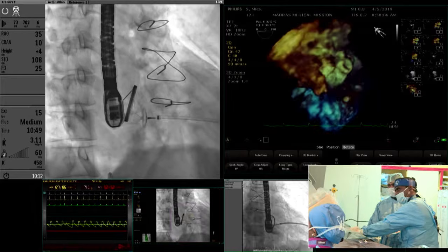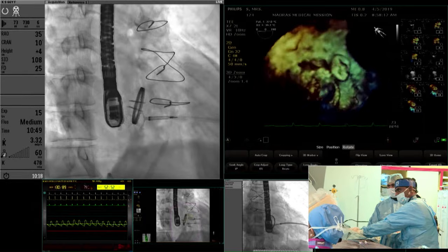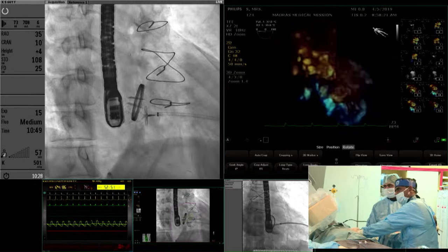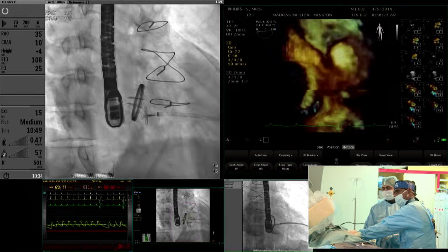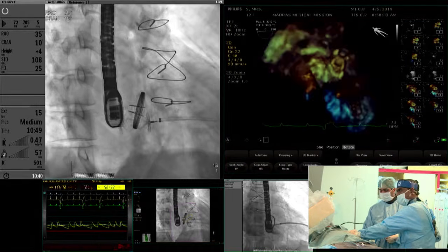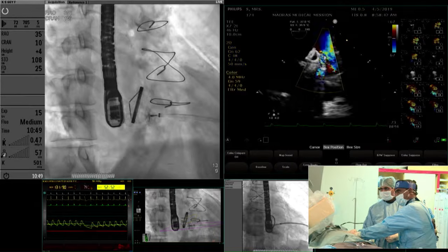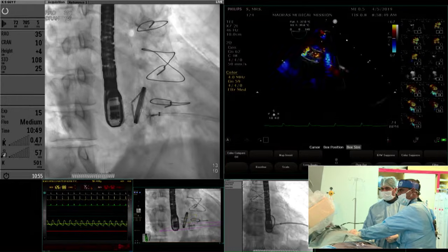Dr. Sivakumar, this is Sanjeev here. Do you ever leave a coronary wire or something across through your sheath so that in case things slip out, you can go back in, or the crossing is easy? Yeah, that is actually a very good technique. The only difficulty with that technique is we may have to use a larger sheath, and since I am going apical with the smallest possible sheath, I try to avoid it, but that is an extremely useful strategy, especially if you are doing it transseptally. In transseptal, you can afford to have a little larger sheath, and so then sometimes we leave a wire. There are times at which we have put in 2 or 3 devices adjacent to each other like a necklace.